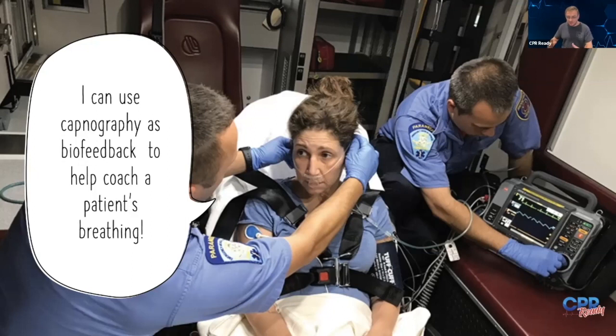We've all coached our anxiety attack patients to slow your breathing down. They're getting all the carpopedal spasms, right? Their face is numb and tingling. And you're trying to coach them, slow your breathing down, slow your breathing down. So if you put them on capno and you orient them to the waveform and the number, knowing that normal is between 35 and 45, if they're hyperventilating from anxiety, it's going to be low, right? Because they've been blowing off more of that CO2.